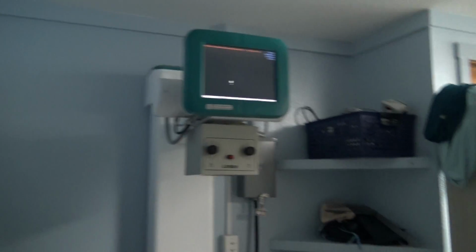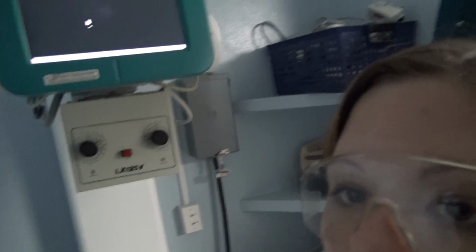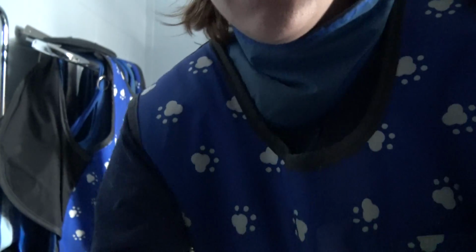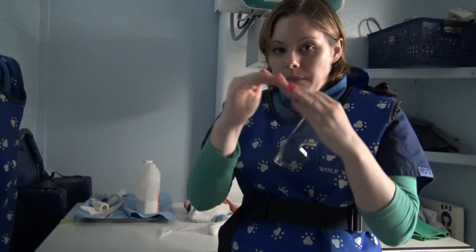All right. And on my x-ray, you can see this little fuzz from the fake stomach that we have, and the marker. So it looks like we have good collimation. And again, you would be looking for the diaphragm and the apex of the heart.